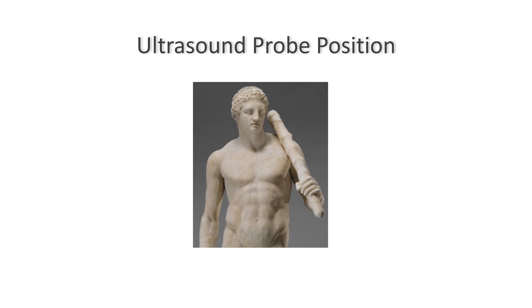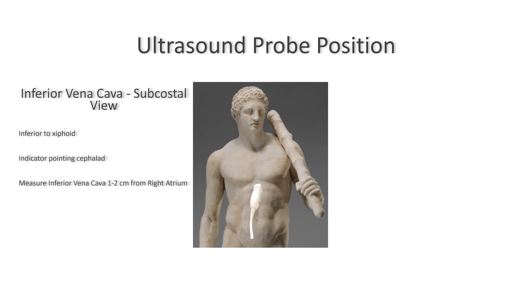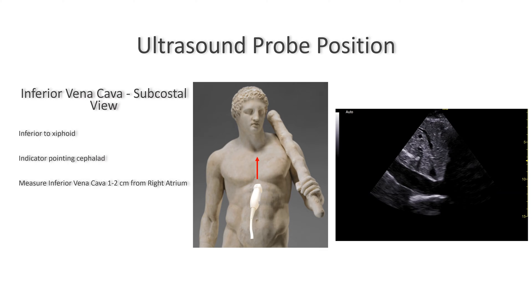Let's talk about ultrasound probe position. As part of the subcostal view you should also evaluate the inferior vena cava. Start with having the patient in the supine position, then place the probe just inferior to the xiphoid process with the indicator of the probe pointing cephalad. You should be getting an image looking like this.